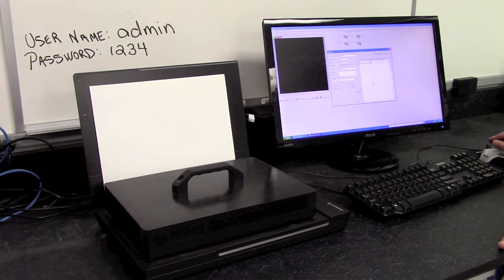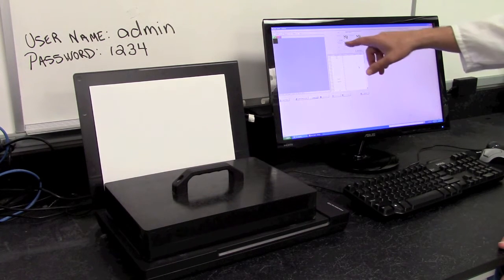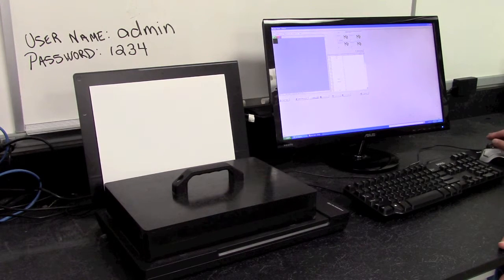When you're done, there's a button here that says add. So you're going to add your plate. You're going to close the screen, and from this plate selection, we're going to select the plate and we're going to add it to be scanned. When we do that, you can see the name of my plate says example, and it's in the top left plate 1 position. And then we're going to hit the button that says scan.